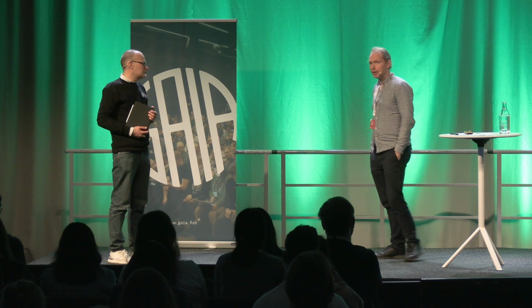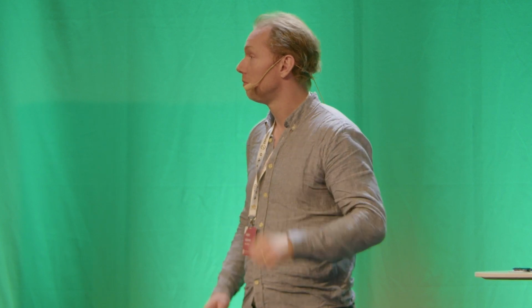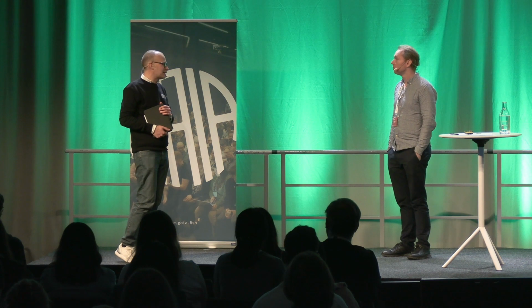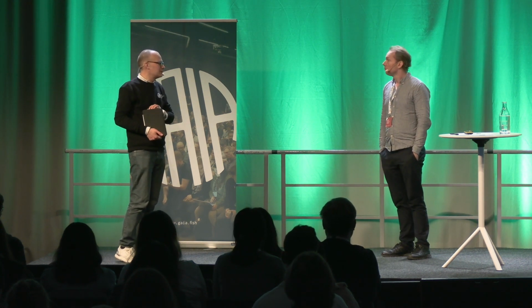Yeah, so the heads we used here was the very simple thing about fusing several parcels. That was the head model. It was just the idea of let's merge these parcels and we get the segmentation. Very simple model, very easy to explain. And for the view detection, it was KNN. Right, and that reminded very much of Maria's approach for the snoring, that you have sort of a zero-shot approach on a pre-trained model. Yeah, that's true.